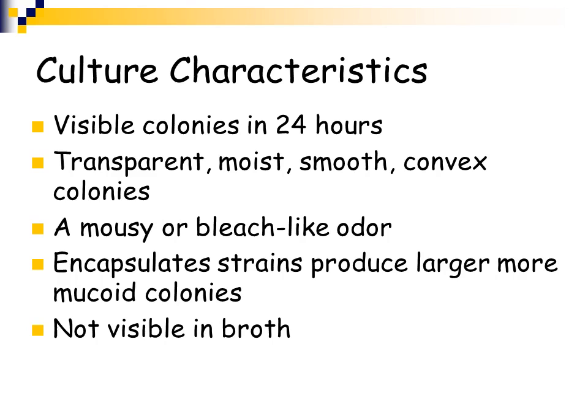way back in the day, even before my time, it was common in the clinical laboratory for laboratory scientists to sniff plates, and people with a lot of experience could just sniff a plate and know what was growing on it by what they smelled. Nowadays, we know a lot more, and sniffing of plates is not allowed at all.